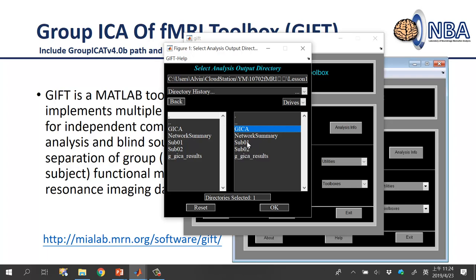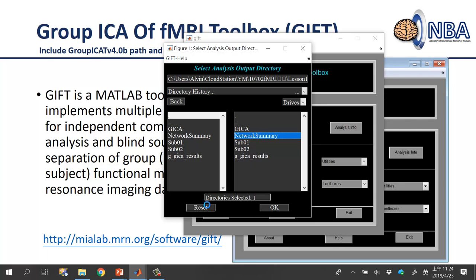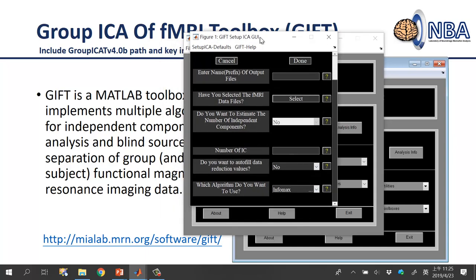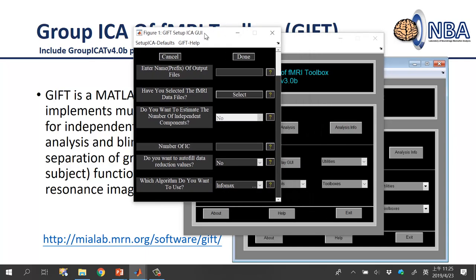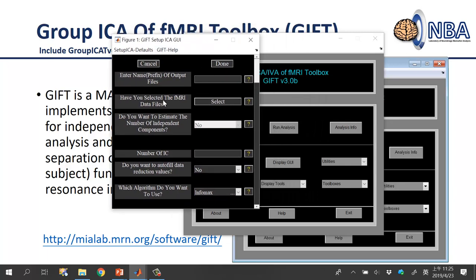If you selected the wrong folder, click the Reset button — the count will go back to zero, and you can select the correct one. Only one output folder is allowed. After selecting the correct output folder, the setup panel will appear.